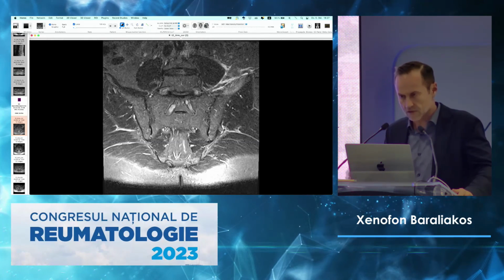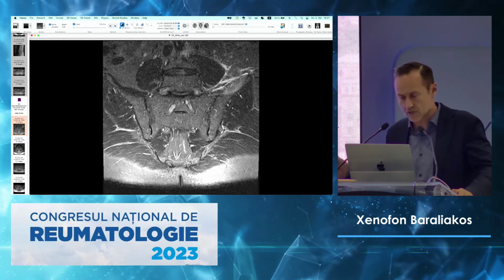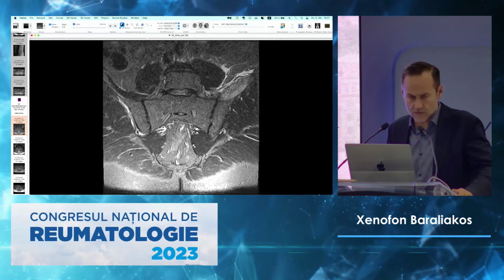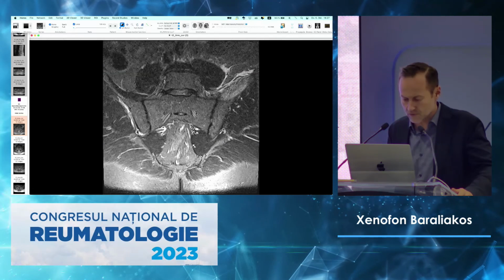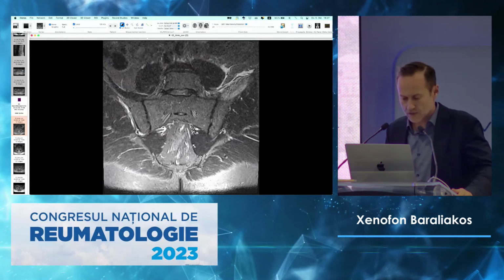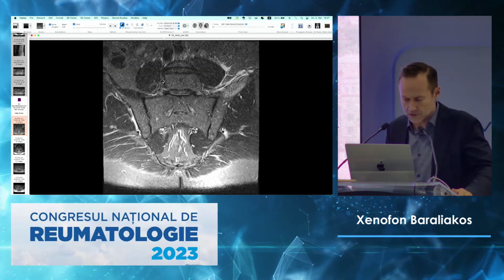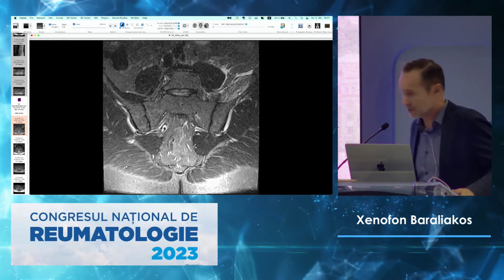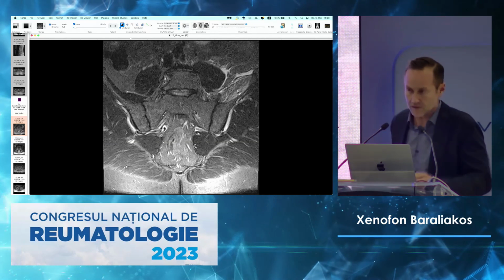So you remember, in the spine there are the facet joints, and here in the sacroiliac joints there is the muscle around, maybe also a bacterial inflammation, the soft tissue edema, and so on. So that patient has now undergone surgery, he is fine, but the problem was a different one. If you give a different treatment now, you will miss it.